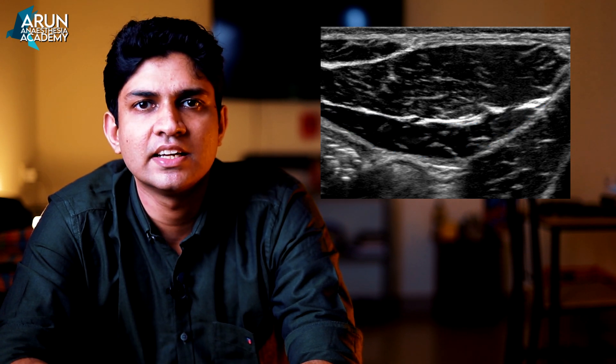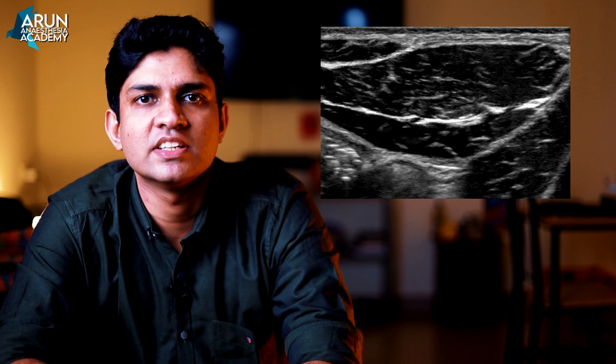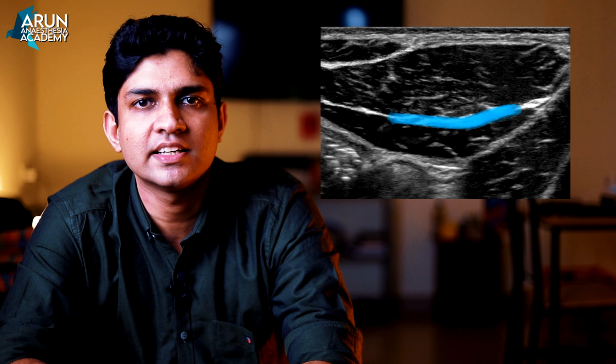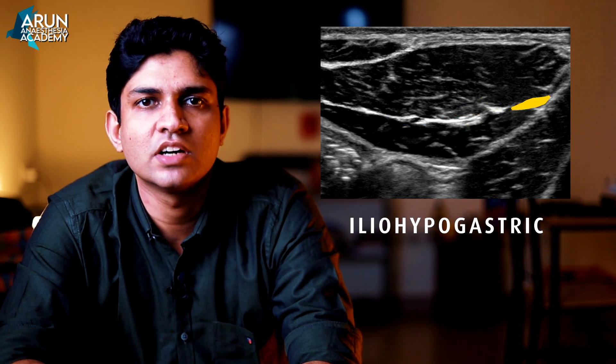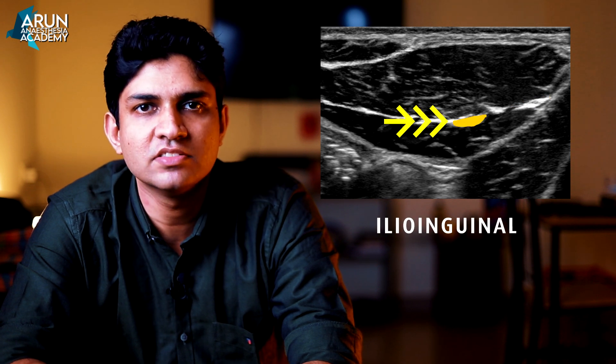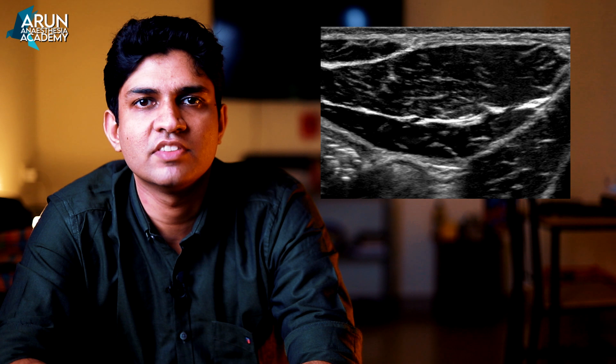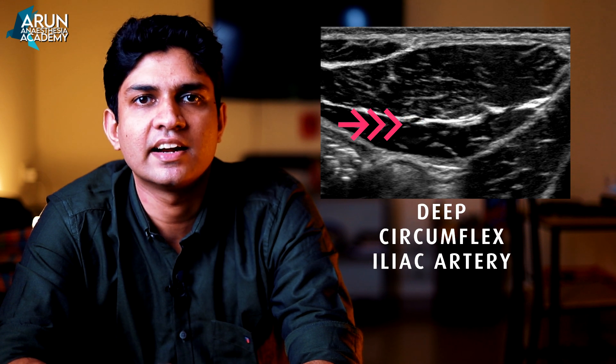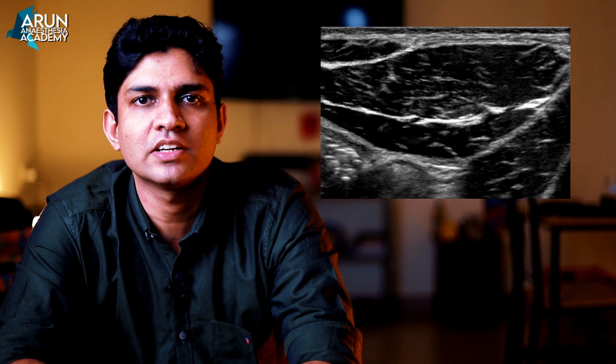The target area is between the internal oblique and the transverse abdominis muscle — the same as in the TAP block. Here we can easily identify the iliohypogastric and ilioinguinal nerves as hyperechoic oval structures in that plane. We can also identify the deep circumflex iliac artery in the same plane; color Doppler helps confirm the vessel's pulsation and clearly identify the plane. It is best to scan more proximally, towards the lateral aspect of the anterior superior iliac spine, to avoid sparing any branches when depositing local anesthetic.